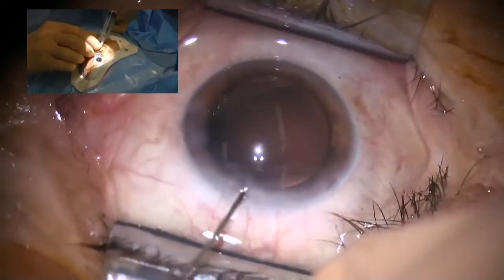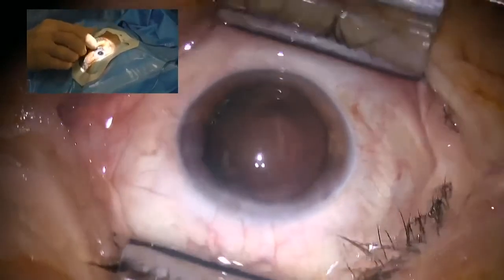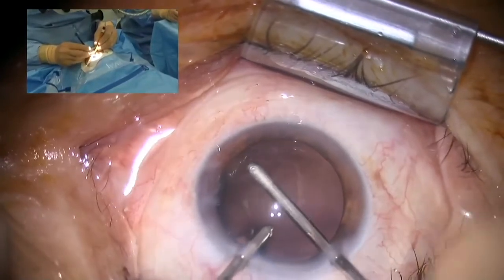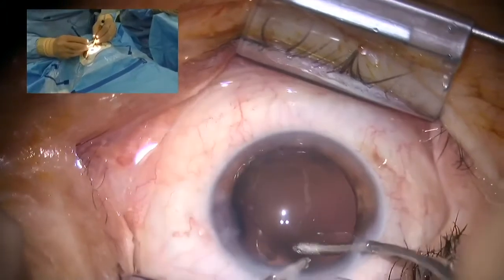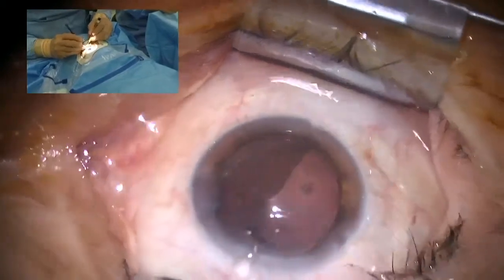Now I use the water jet to clean the capsular bag. Removal of some more fibers. Very good.